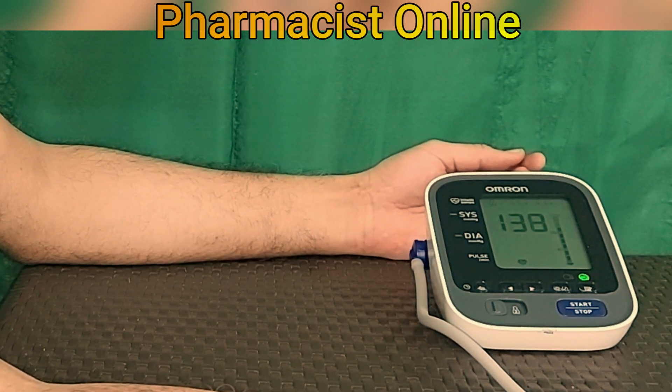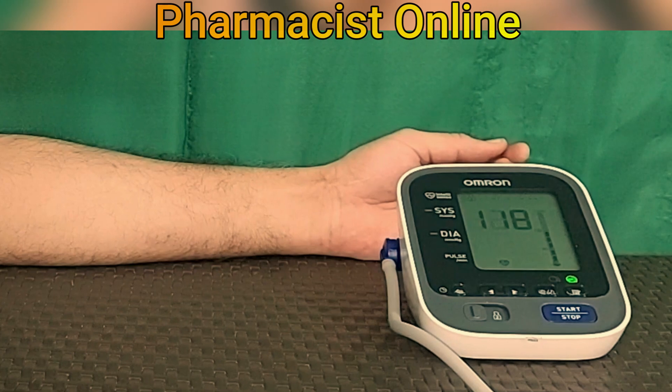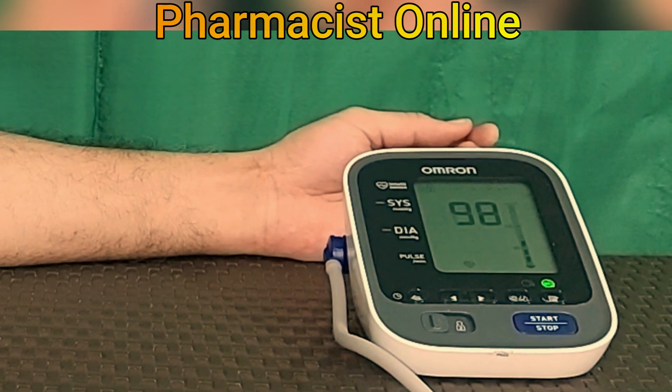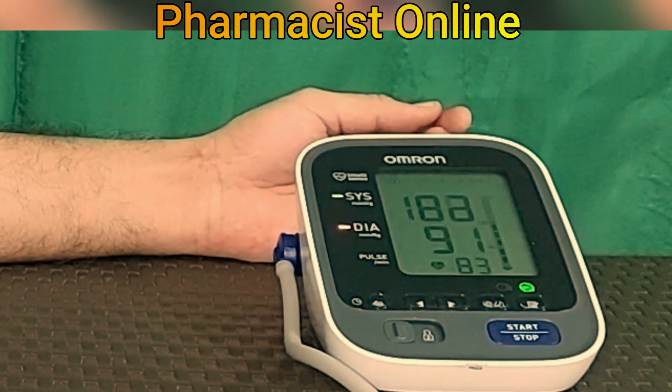Similarly, if you measure BP with the left hand and get high BP results, use the left hand for BP measurement. The best approach is to consult with your physician, who will quickly assess which hand is suitable for BP monitoring.